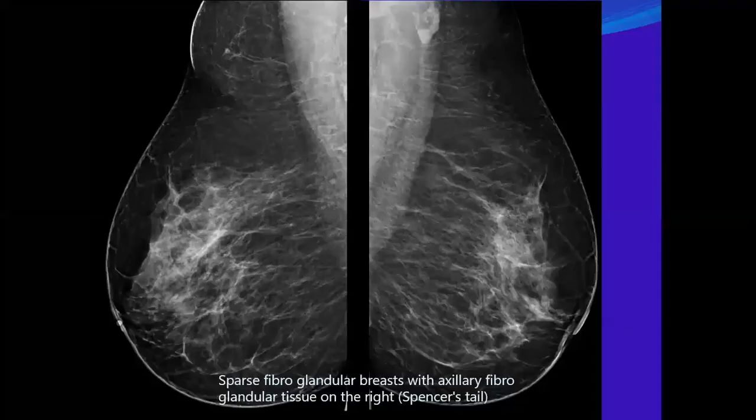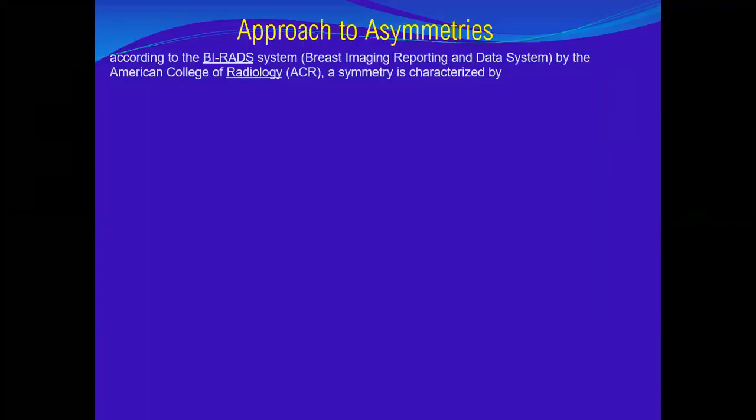Okay, what is the asymmetry here? It is obviously seen if you look here. You have an asymmetry toward the axillary side due to an accessory breast, not seen in the contralateral.